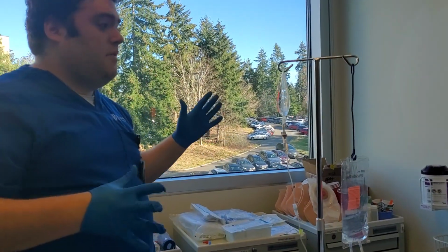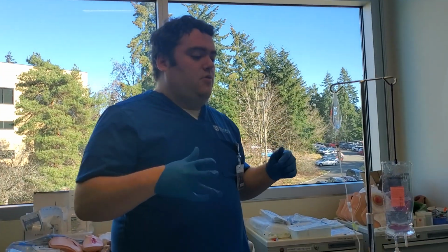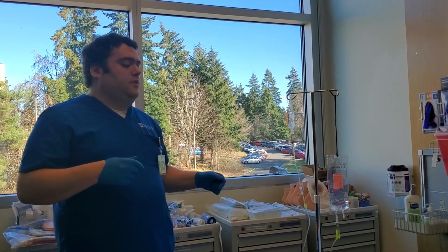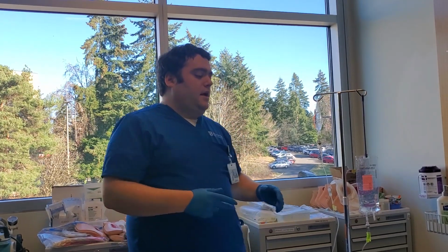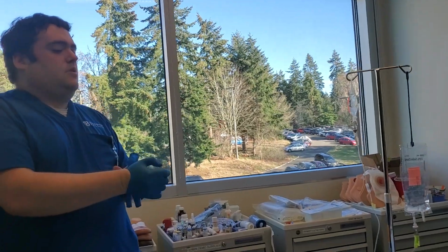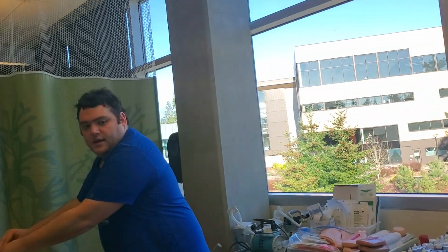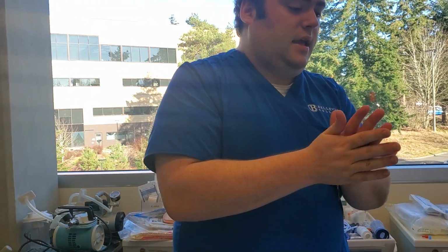So then, now that everything is set up, I'm going to ask her if she needs anything, are you in any pain? We're then going to go ahead and lower the bed to its lowest position. Alright, I'll do hand hygiene. And then we're going to go ahead and put the call light there. And then we're going to go ahead and document. Alright, thank you so much.